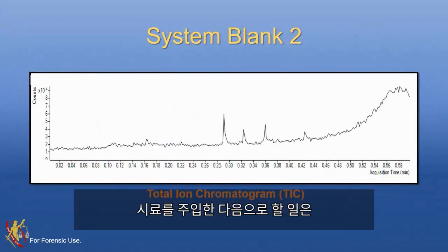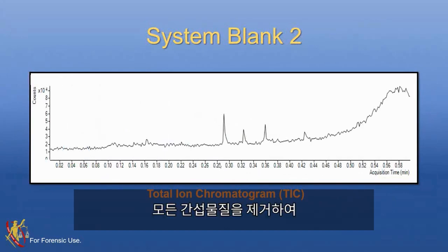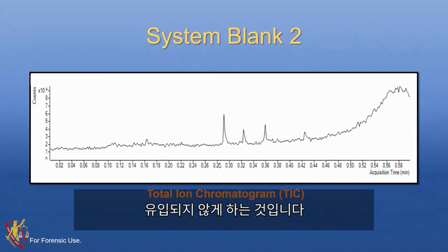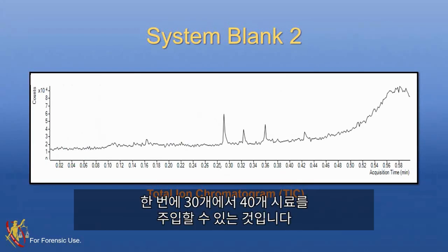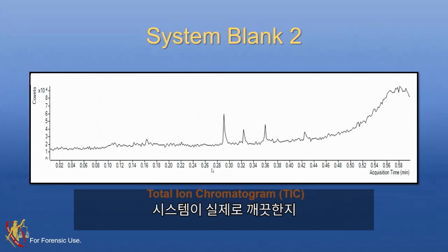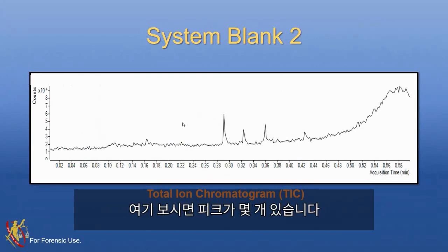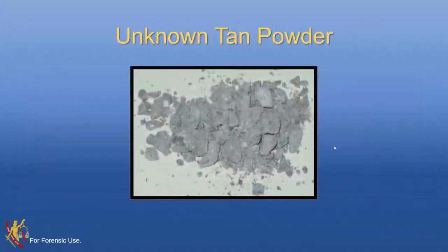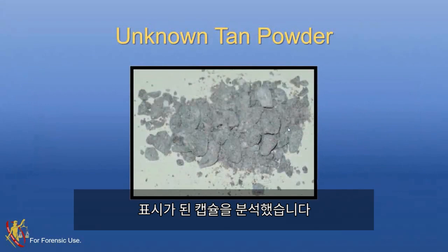After injecting our samples, we run a second system blank to clean out everything and ensure nothing from the previous sample carries into the next. Because we want to inject 30 to 40 samples in a day, we can't have something from six samples ago showing up. We run the second system blank to verify the system is actually clean, or whether we need to pause and clean out the system. What you're looking for here is just a nice blank chromatogram — if you see peaks, you hit pause.